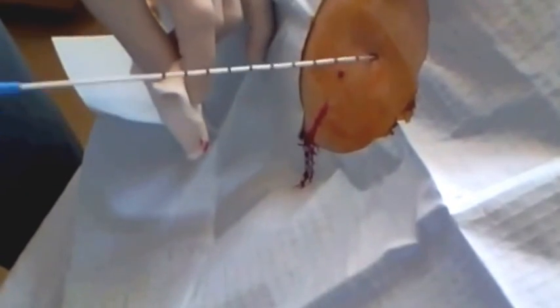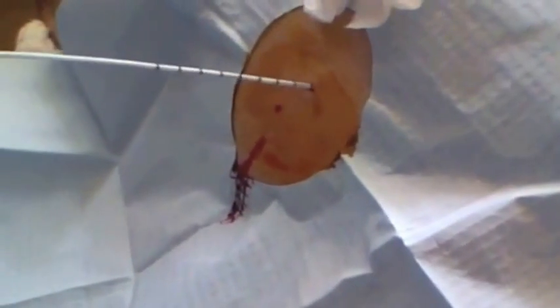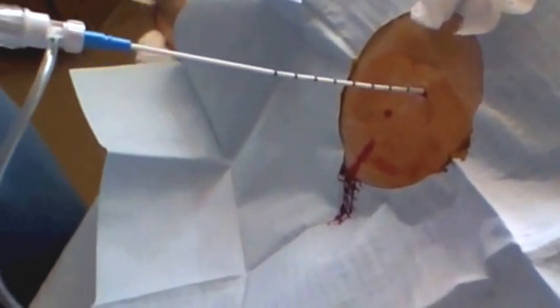When you go to put the catheter into the patient, you're going to have a tendency to want to grip the end of the catheter. Don't do that because that's going to go into the patient. Even if you're wearing sterile gloves, you don't want to do that. So don't hold the end of the catheter — just kind of wiggle it in there, like a sword. Get it through the subcutaneous tissue.